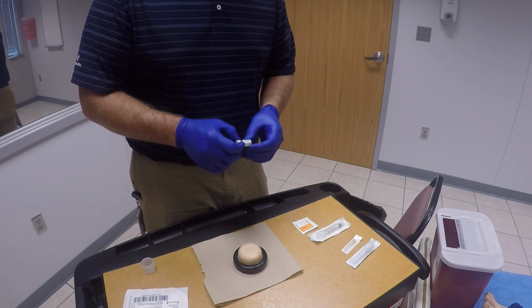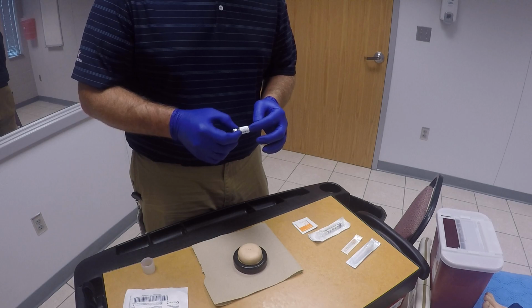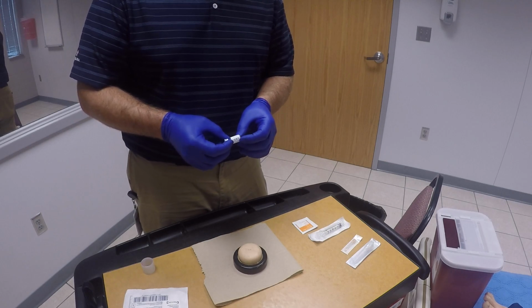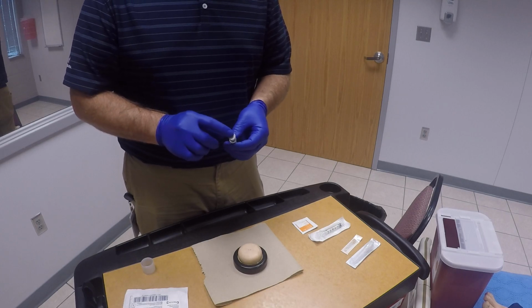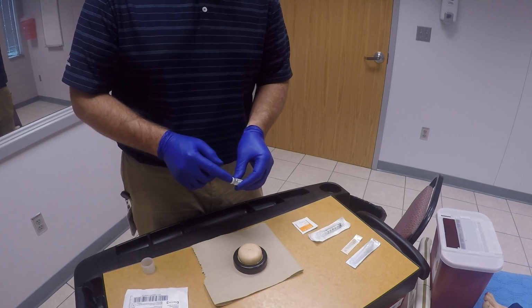We want to check our medication, make sure it is the right medication as we said, make sure it's not expired, and make sure it is clear, there's no particulates floating around in there or anything like that, and make sure we do have a nice clean cap here still on.